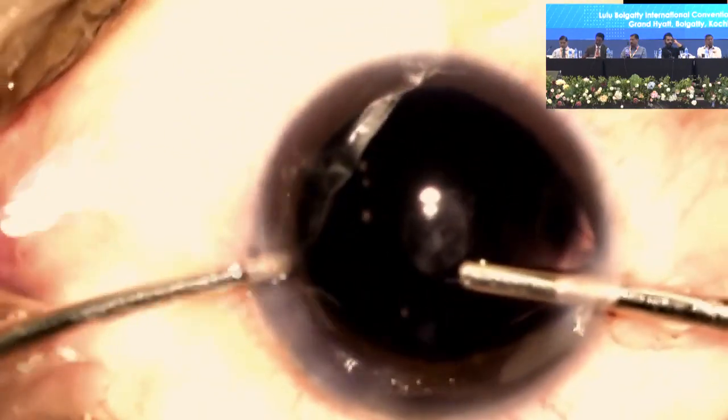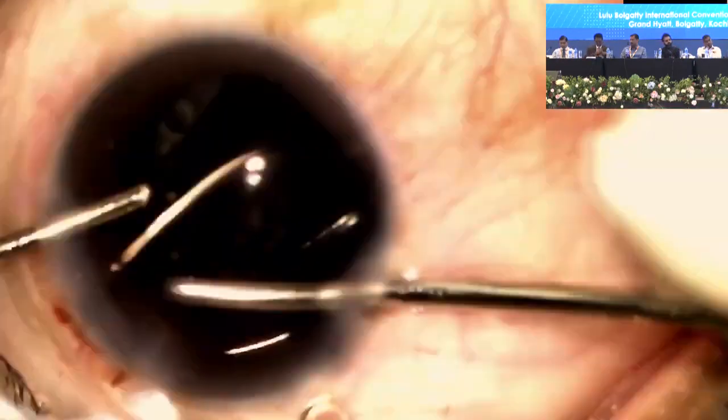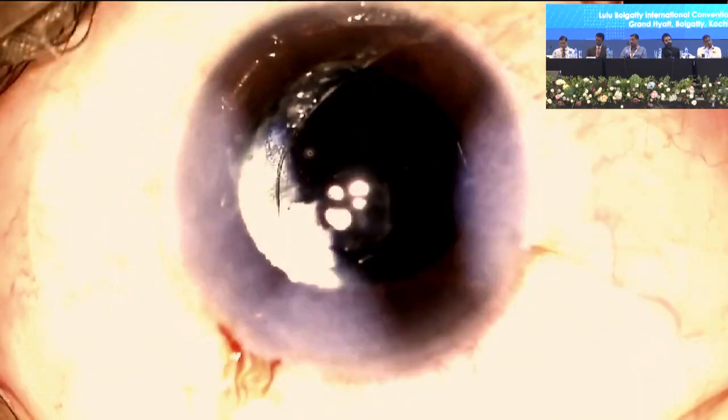We perform a viscofluid exchange, then introduce the IOL and do a visco wash and hydrate the wounds, and this is the end result that we achieved.